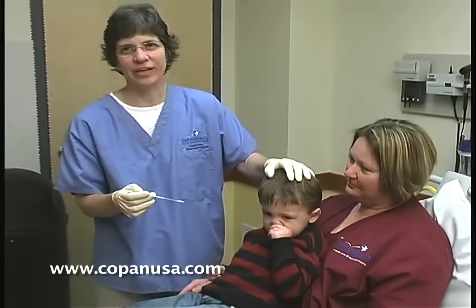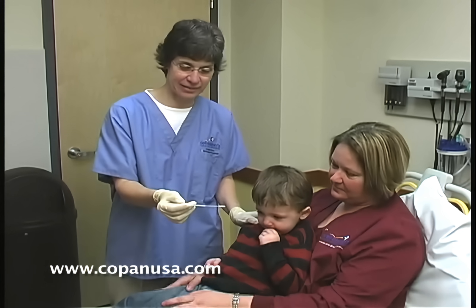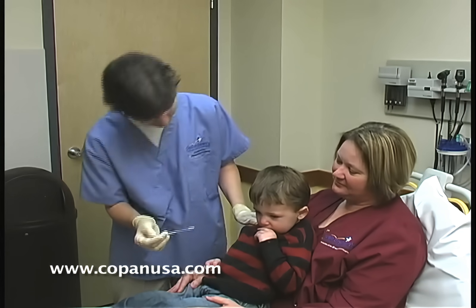You can see he got upset for about two seconds. As soon as we got our nice sample, you can see there is some great mucus on that swab. Thank you, Rowling.